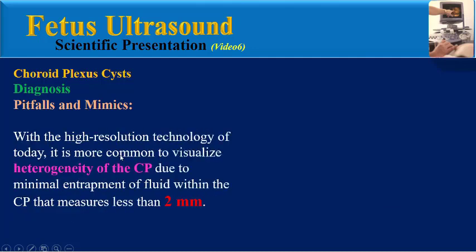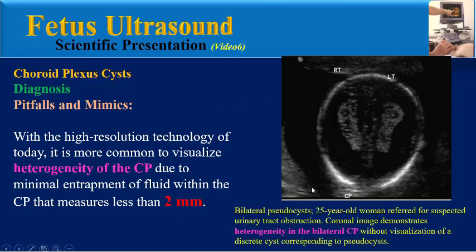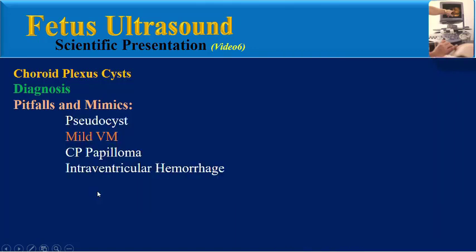With the high-resolution technology of today, it is more common to visualize heterogeneity of the choroid plexus due to minimal entrapment of fluid within the choroid plexus that measures less than 2 mm. This coronal ultrasound image demonstrates heterogeneity in the bilateral choroid plexus without visualization of a discrete cyst, corresponding to pseudocysts.